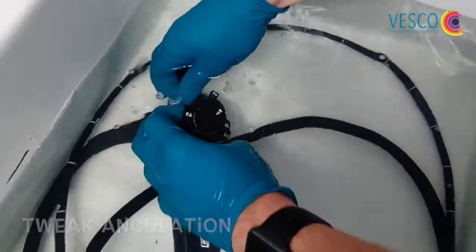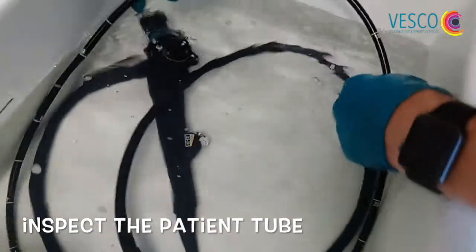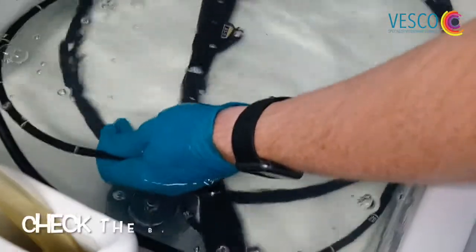Tweaking the angulation a little bit. Moving the bending section.